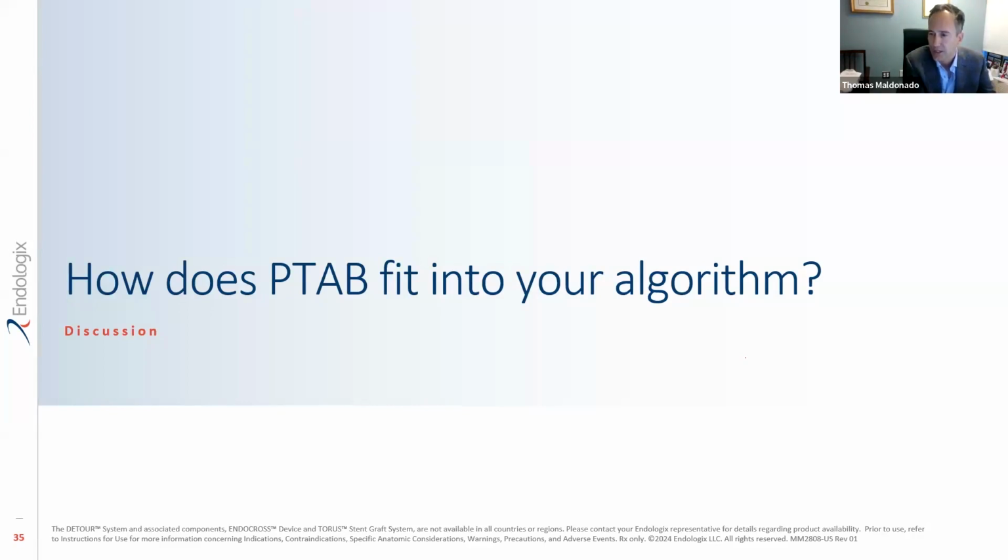Not another set of eyes, but also move the case along. I don't know. Do you do them alone, Vince, or? No, we try to do them all in tandem, and it's made life a lot easier. It's exactly like you said, Tom. Somebody's working on the venous, somebody's working on the arterial. You're getting that 8 French sheath over, and then when you externalize your wire, you've got your rail, and somebody's always holding on that floss wire while you're advancing the devices over the top of things.